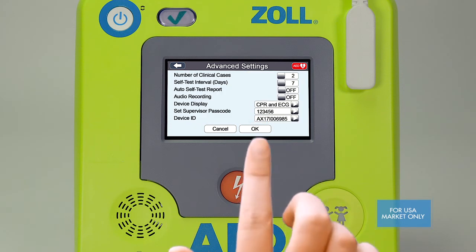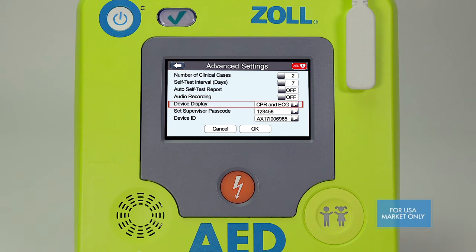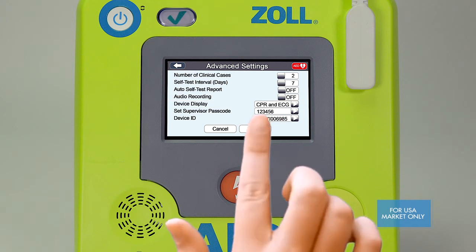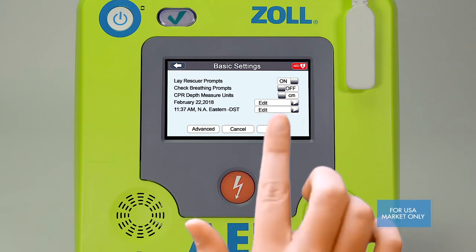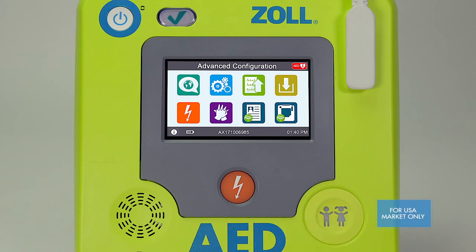The device display feature allows you to select how feedback data is displayed on the screen during a rescue. When you've completed changes on this page, make certain you save your configuration by pressing the save button.